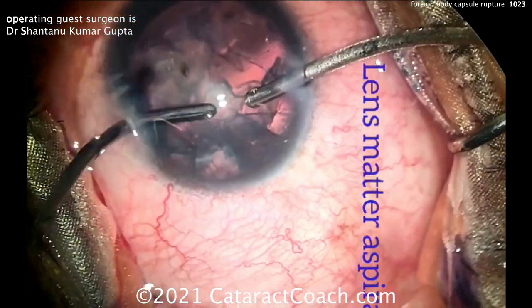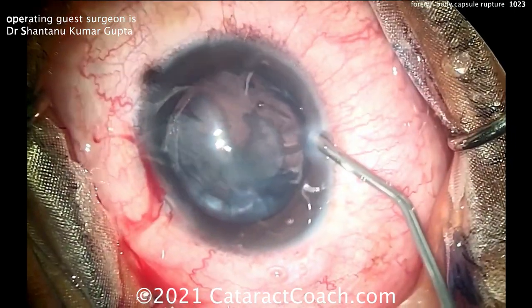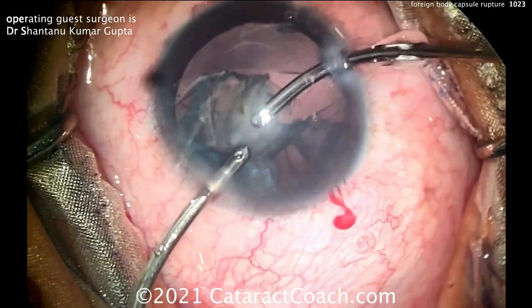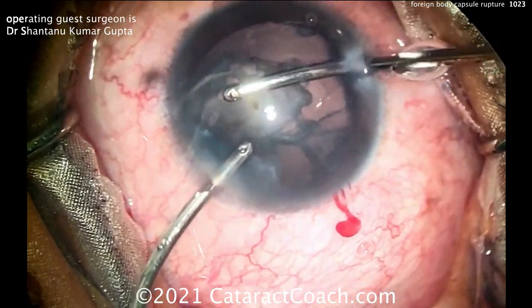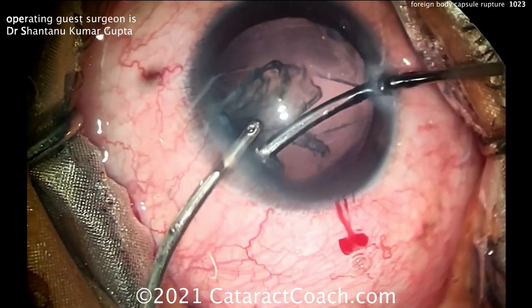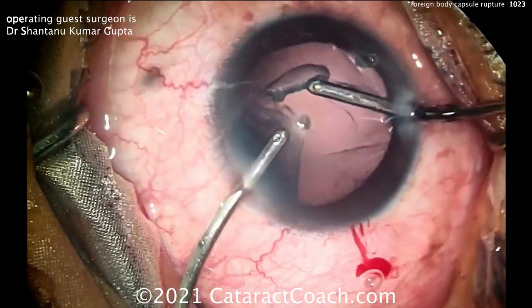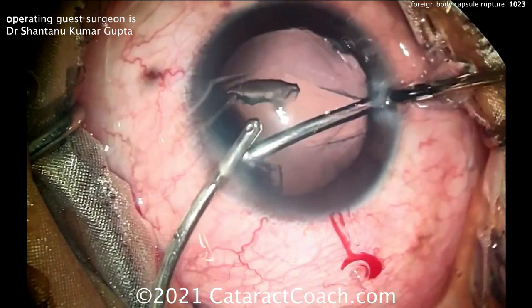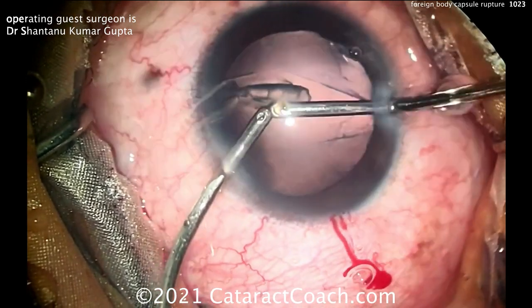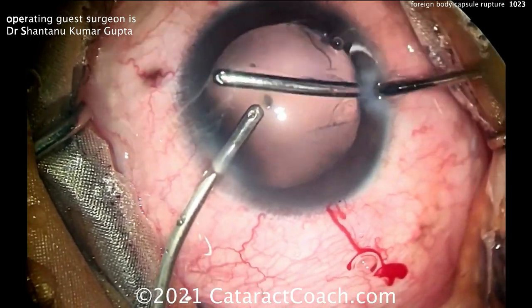Because the lens is soft in this young 30-year-old patient, you can just use bimanual IA to remove all the lens material. Be careful not to touch the lens capsule edges, because you don't want that irregular anterior capsular opening to zip back to the posterior capsule. Lens removal is very easy here — the patient had no nuclear sclerosis whatsoever due to their young age. Once you remove all the lens cortex, you'll be able to see the outline of what you have for the capsule, and it looks pretty reasonable. The patient can have a nice intracapsular fixation of the IOL, so you get the lens in the bag.